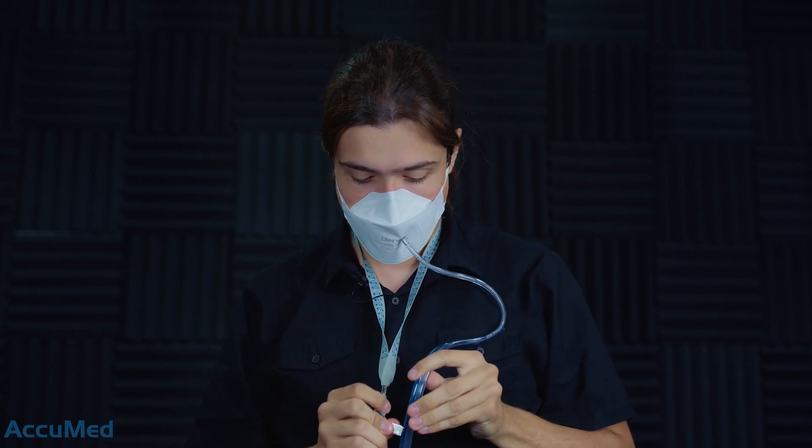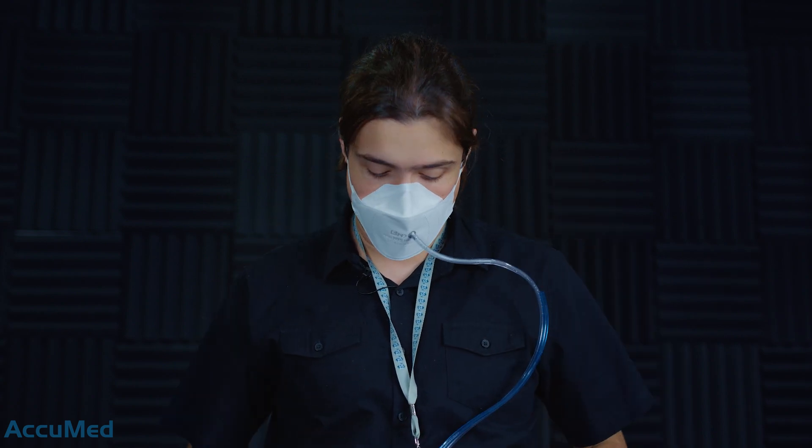All right, now he is fitting the mask onto his face. He has to push it a little bit into the nose piece to create a perfect fitting and sealing. The next part is to attach the lanyard to the tubes, so the tubes are not dragging on the mask, which helps us get accurate fitting factors at the end.